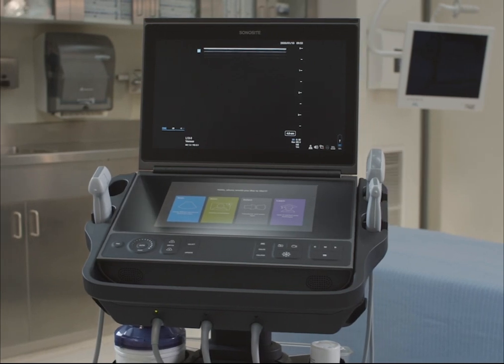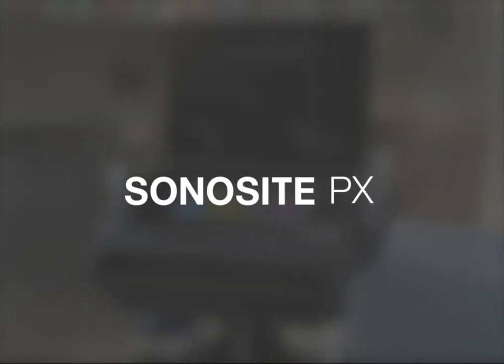Welcome to the Sonosite PX Help video: Getting Started. In this video, we'll show you how to start using the system.